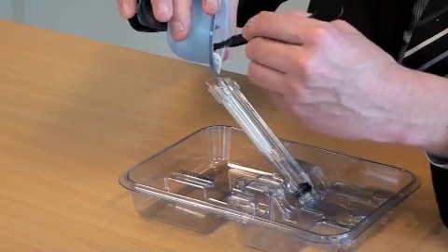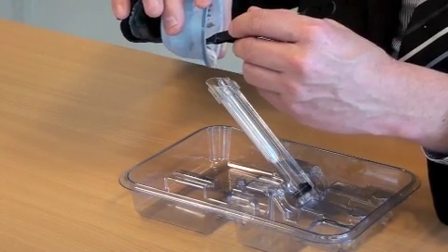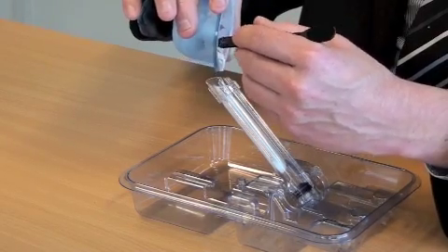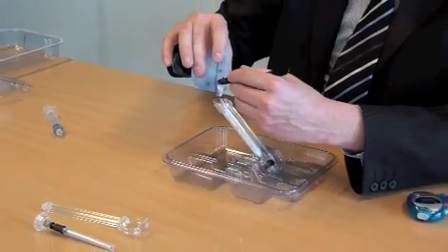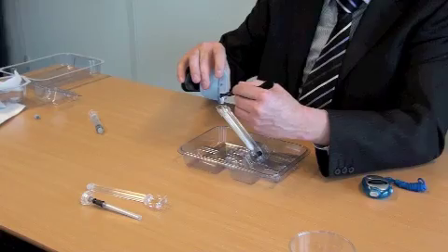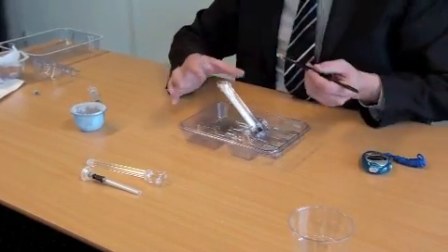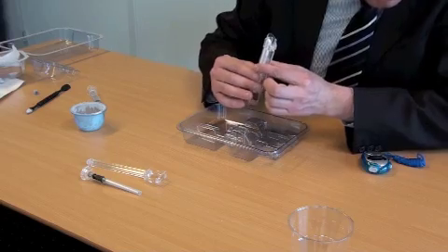So this illustration is actually of a 5cc sample, but I'm just going to take a little bit more time as if I am actually now putting a 10cc into the syringe. So I'm just pretending like I'm filling a little bit more and let it continue to slide down into the syringe. So now, assuming that we have fully loaded a 10cc amount, I'm just going to make sure that the last Hydroset is actually in the syringe. We avoid contact with a full hand. And now it is 2 minutes and 12 seconds.